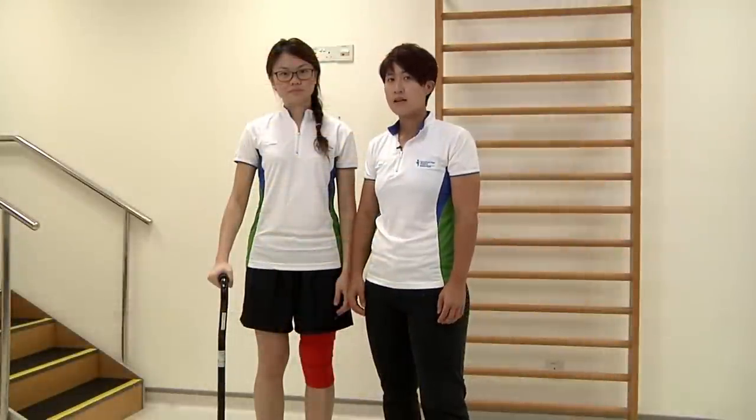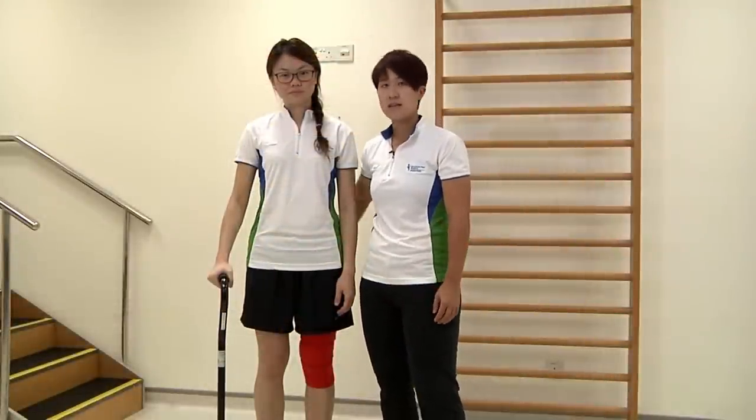To help your loved ones, always stand by them on the painful side. Place your hands around the waist like that.